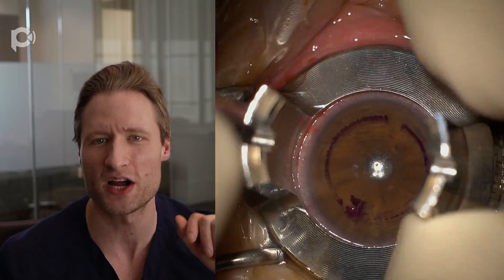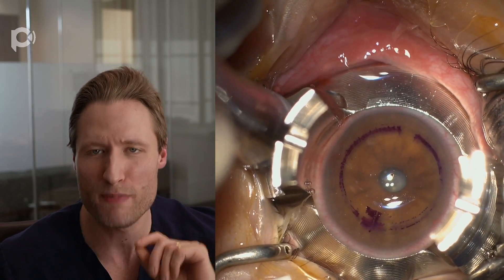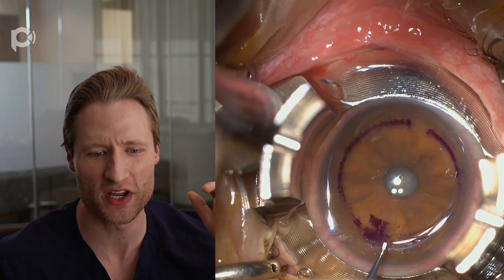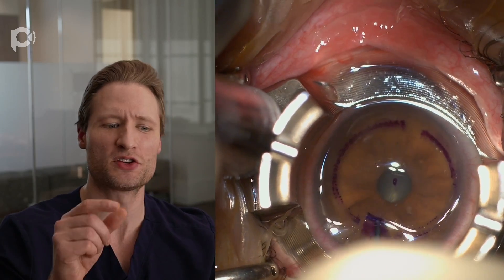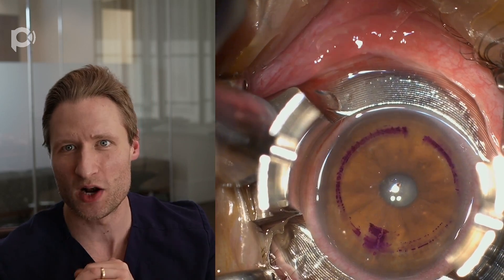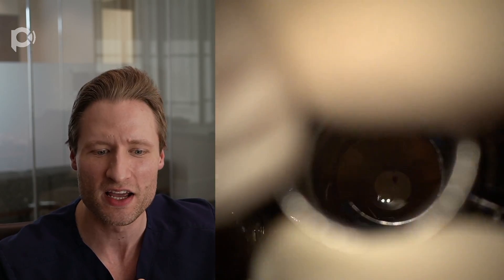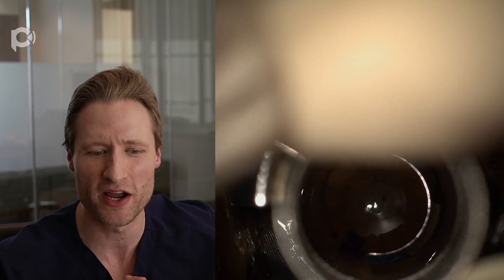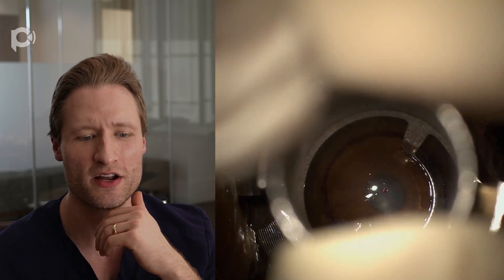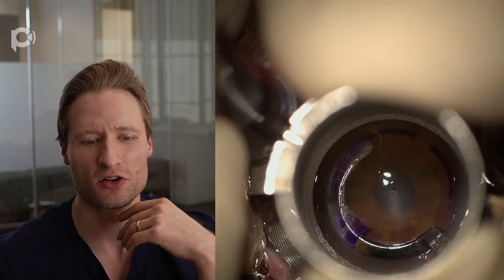This is a suction ring, which I'm fitting to the surface of the eye — it holds the eye very securely for me to manually dissect a single channel in the cornea. Now I have the suction ring engaged. This is a pocketing hook, and I'm using it to spread a little potential space down at the base of that one-millimeter incision. Once I have that potential space dissected, I'll use what's called a symmetric glide in one hand and a corneal separator in the other. The symmetric glide goes into that pocket and lifts up so I can insinuate the corneal separator down underneath it and spin it around to bluntly dissect the channel in the cornea.